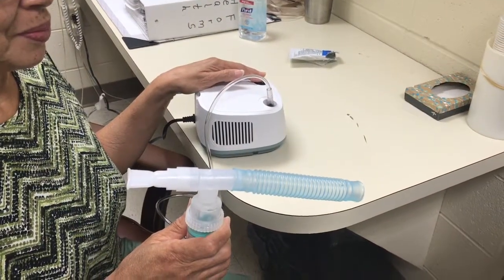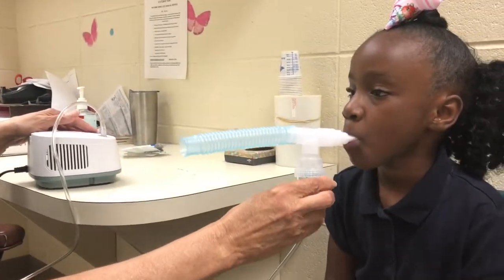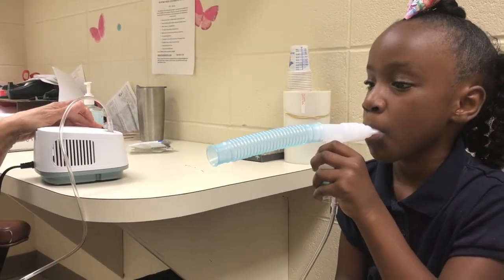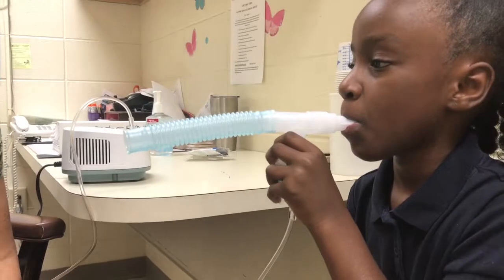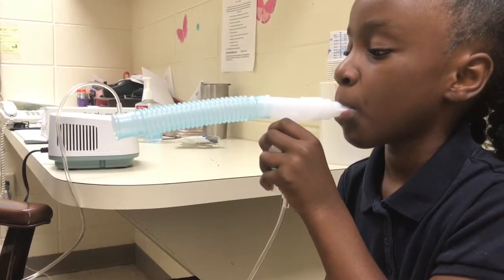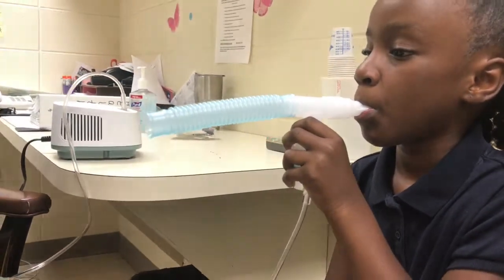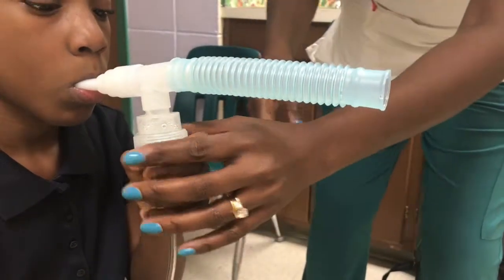Using the mouthpiece with an older child, or if a face mask is unavailable, encourage the child to take slow, deep breaths through their mouth, inhaling as much of the medication as possible. It normally takes approximately 5 to 10 minutes to complete the nebulizer treatment. Toward the end, you may begin to hear a sputtering sound as the medication level decreases.